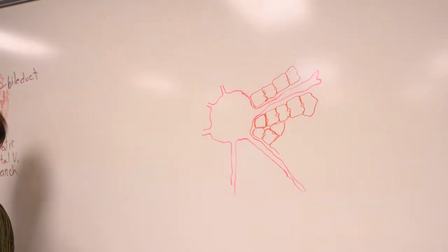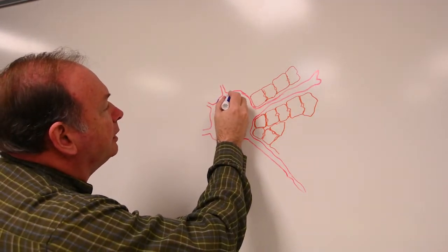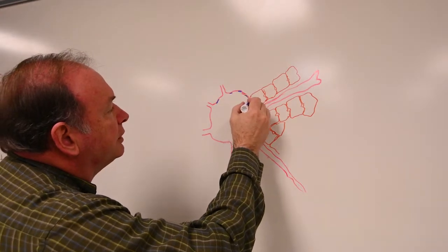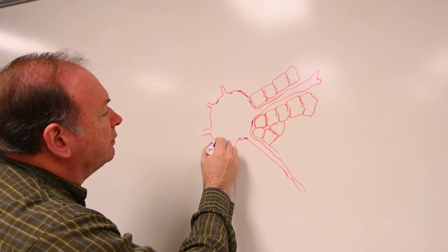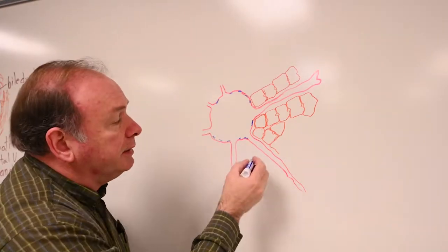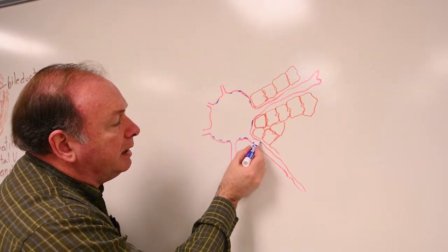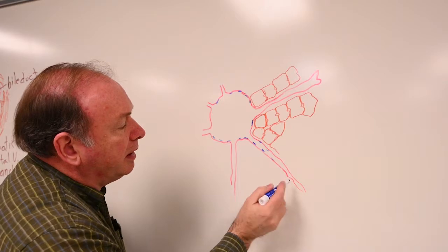There will be simple squamous cell nuclei, these endothelial nuclei, on the inside of our central vein, so that will be an easy to spot feature of our central vein, the simple squamous cells. Those simple squamous cells, endothelial cells, radiate out into these sinusoids out here.